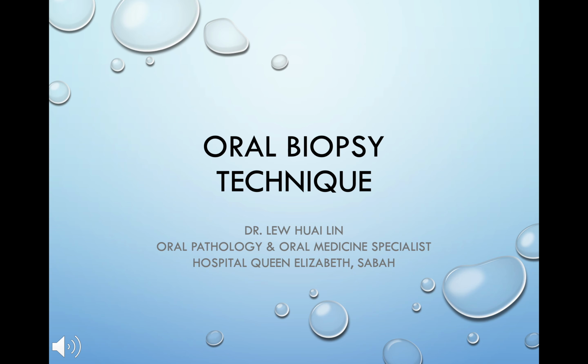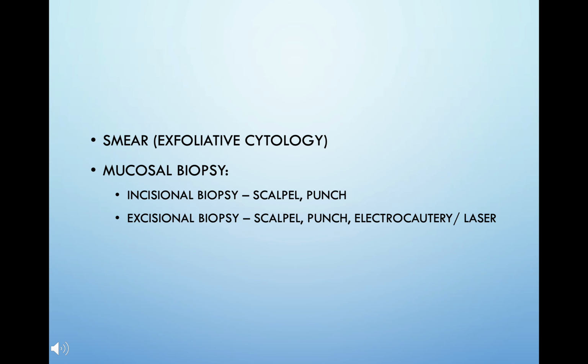I'm going to show you a few videos on oral biopsy technique. These are the techniques that are usually practiced in dental services. Smear, which is one of the exfoliative cytology, is commonly done in oral medicine clinic to rule out fungal infection. It's a cytology because we are examining the cells rather than tissue.